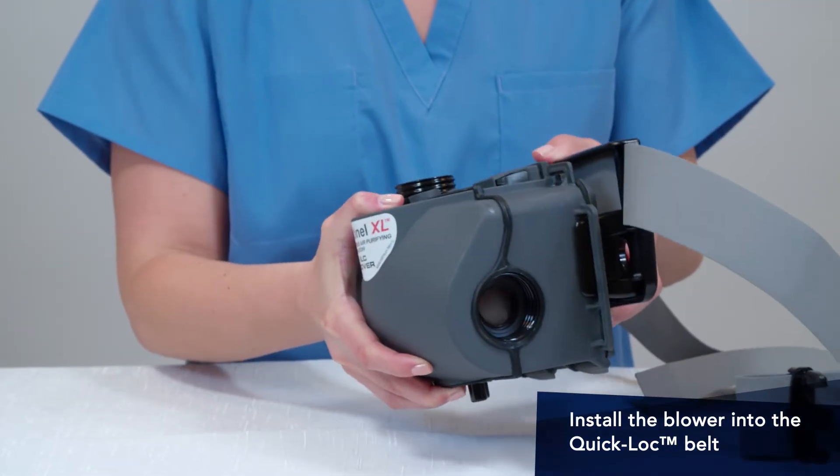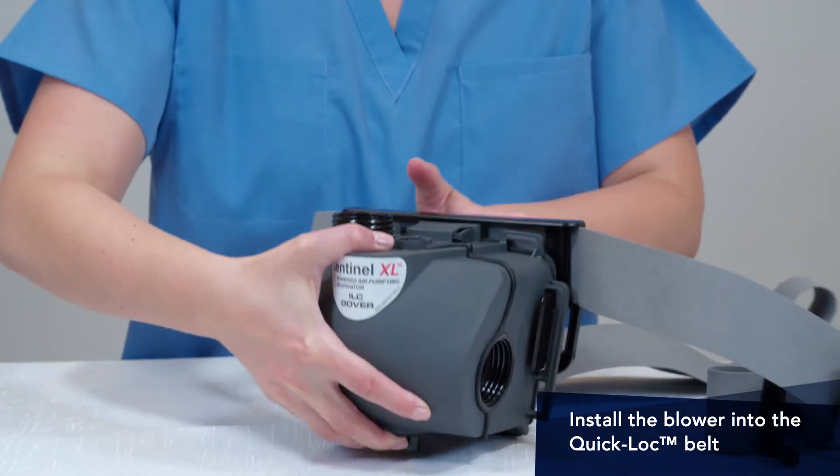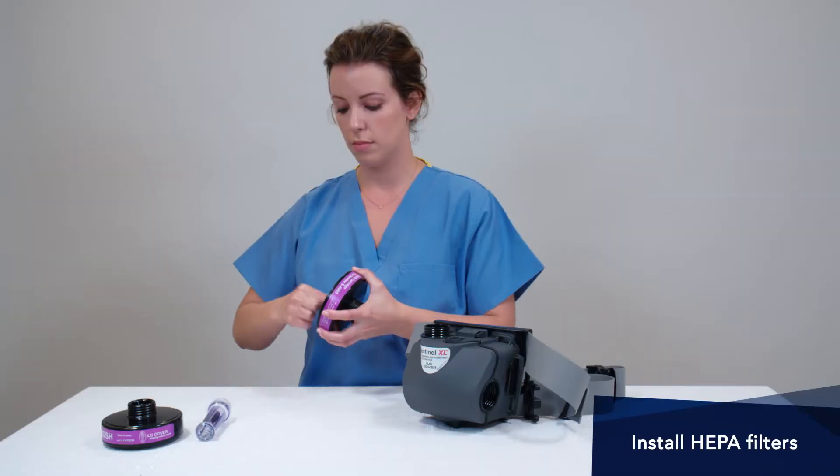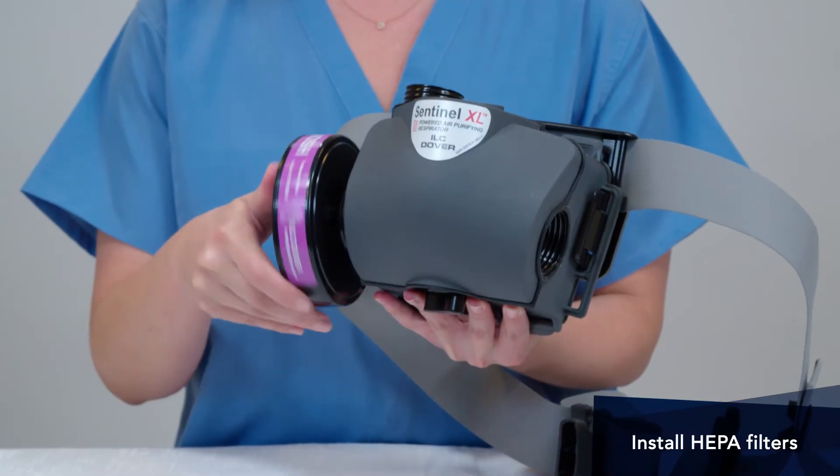To ready the blower for use, attach the blower to the waist belt. Next, attach the HEPA cartridges by removing the filter plugs and then threading them into the blower.